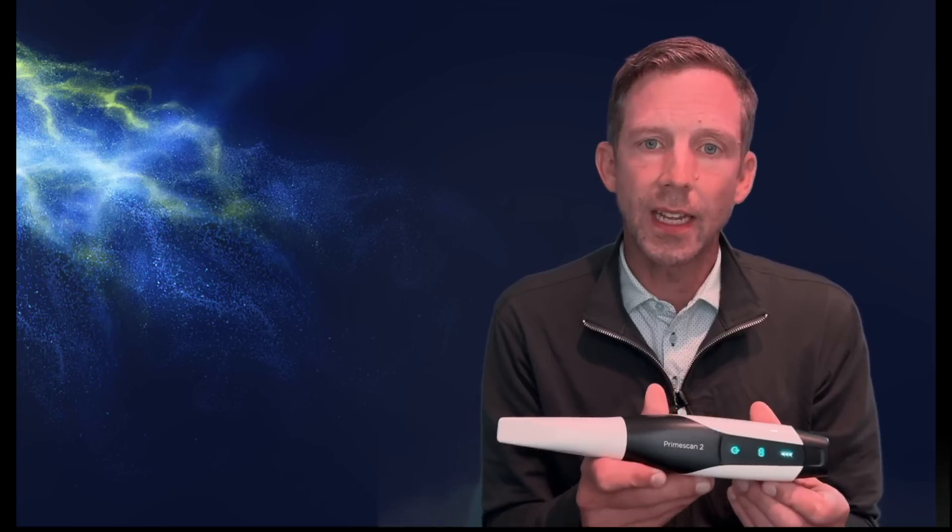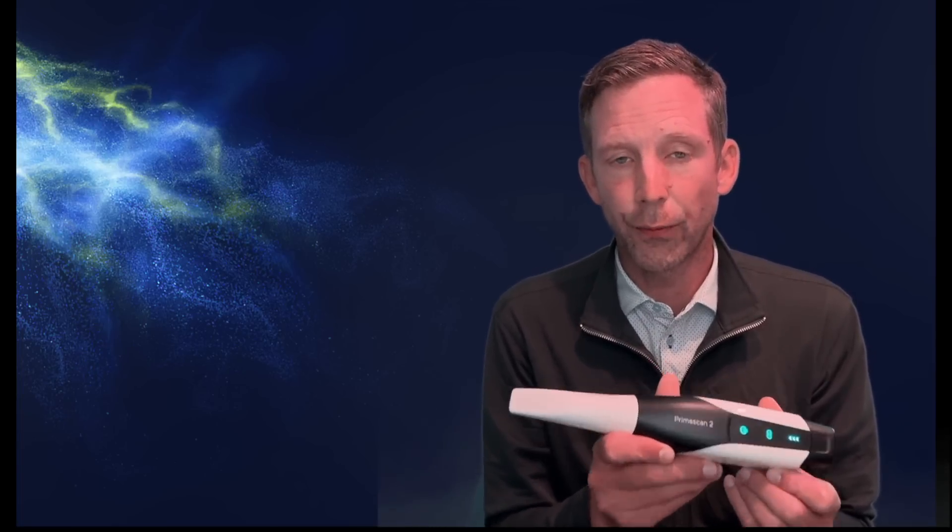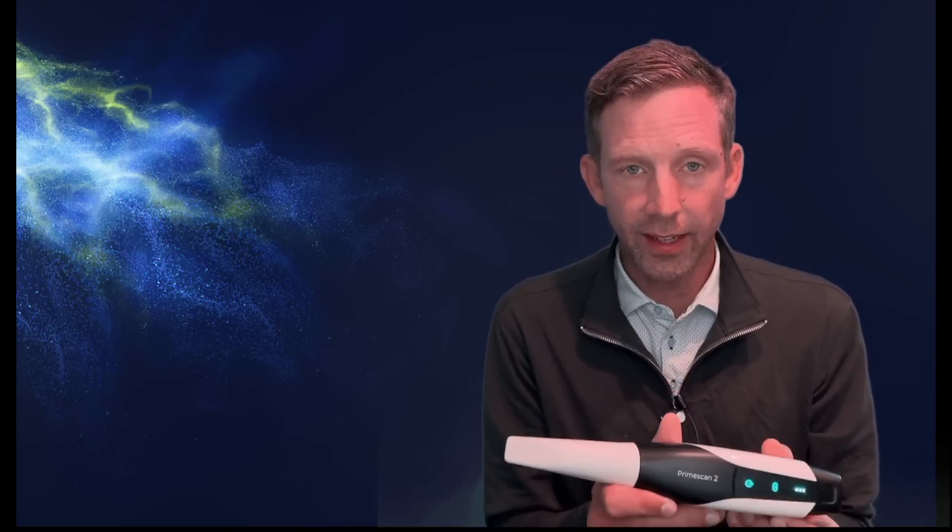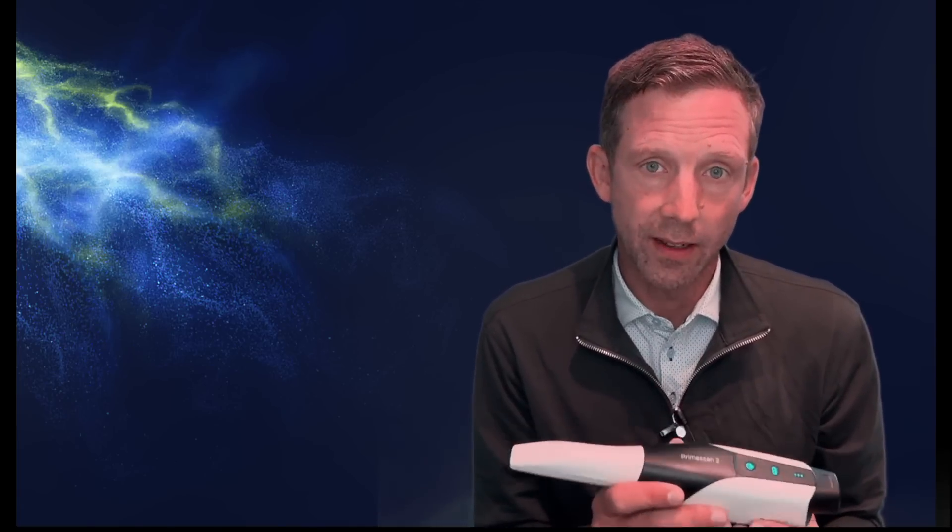Now, there's other wireless scanners on the market, so that in itself doesn't make this particularly special, but what makes PrimeScan 2 really special is it's the first cloud-native scanner on the market today. So what does that mean, cloud-native scanner?